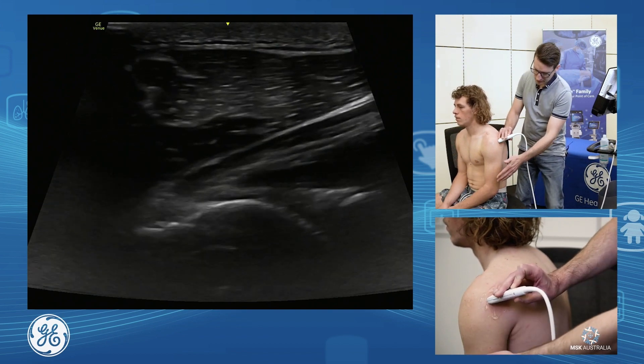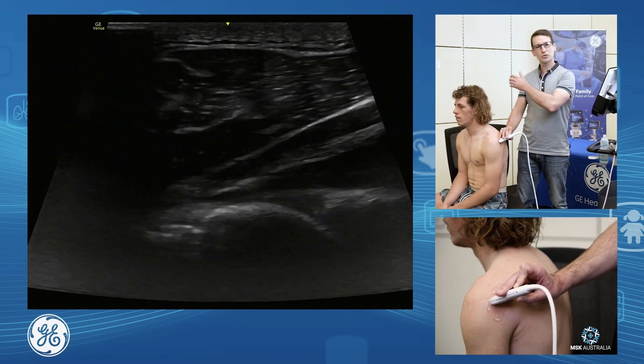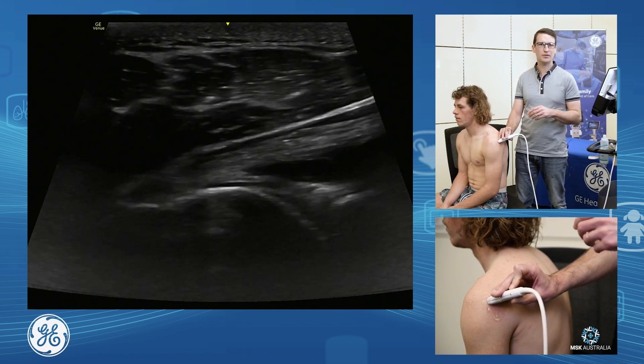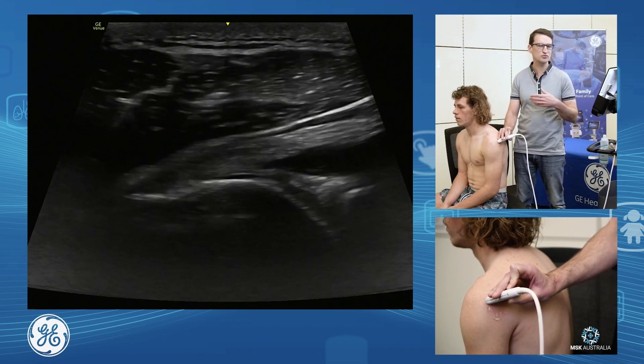I've got the hand in a really nice neutral position. If we reach the hand across the body, that will push and stretch those muscles across the back of the capsule and push joint fluid away. So we like to assess this in a nice neutral position.